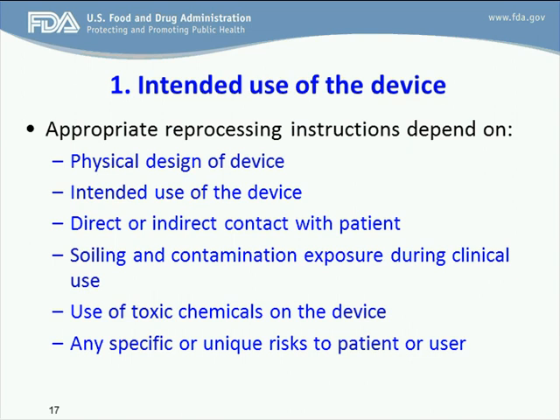In addition, it depends on the use of disinfectants or other chemicals that might leave harmful residues or adversely affect device materials or performance if inadequately rinsed, and any specific or unique risks to the patient or the user.